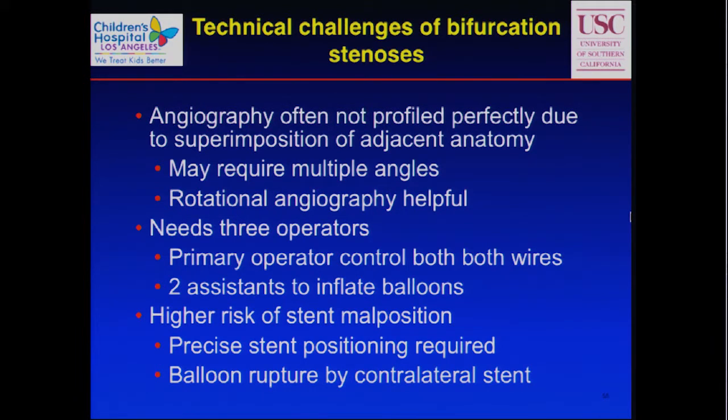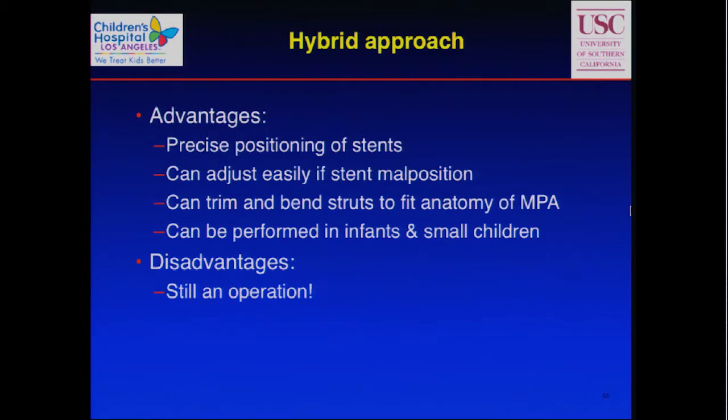There's certainly a higher risk of stent malposition, so precision of the stent implantation is really important. You also have to worry about balloon rupture, because if the stent edge punctures the other side, that can be a problem. That's why I like to pre-dilate to test it first.